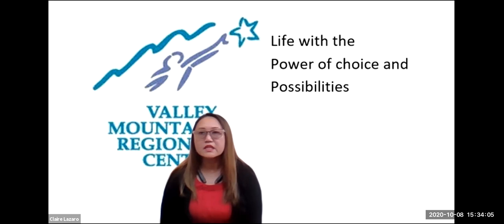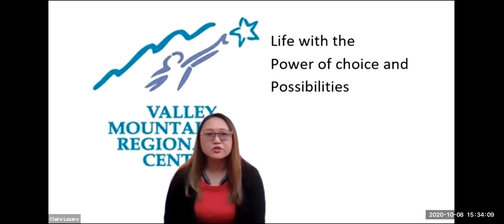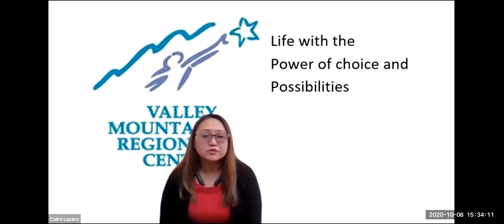I do, Claire. It's Debbie. Hi, Debbie. Do you want us just to put down the observations of what we saw, what was indicated? Do you want us to put a pass or a fail? I'm just kind of curious how you want it, and what would indicate a fail if it's pass fail? Like if there was one thing on the history, would that be a fail? Yeah, if there is one thing in here, for example, in the eye structure, if one thing is checked there, you want them to go and refer to their pediatrician to have that investigated.